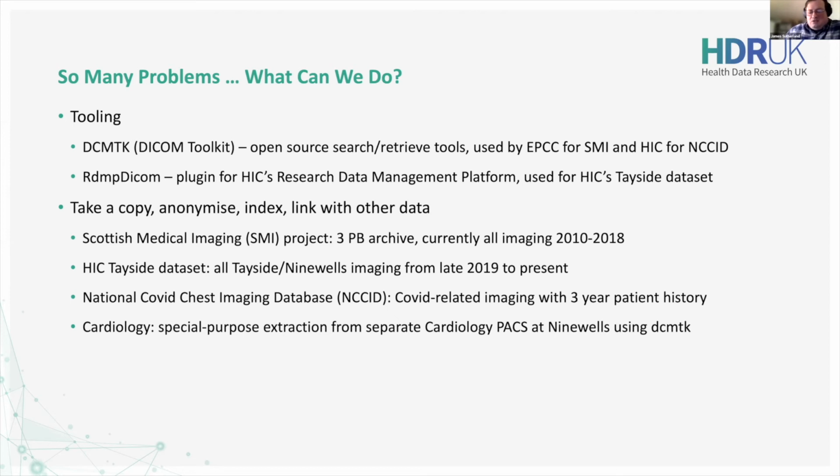It spoke the same language as a radiology PACS, but it had different data in it that could only be obtained by talking to cardiology and was needed for that particular research project. It's been interesting talking to non-radiology departments about their imaging needs.